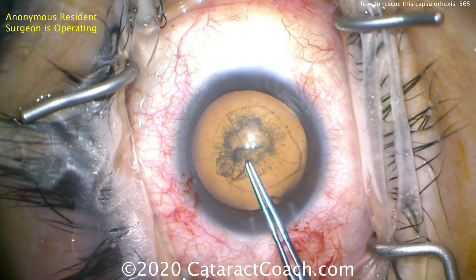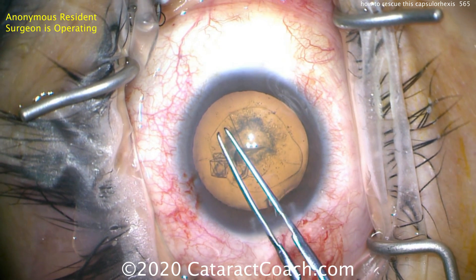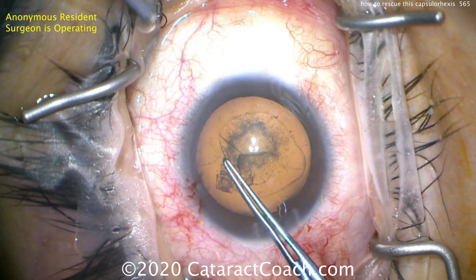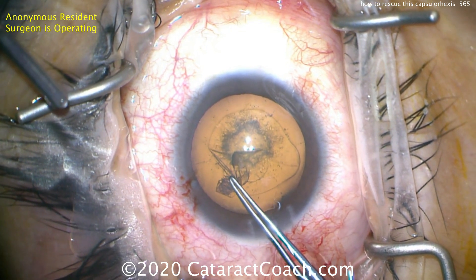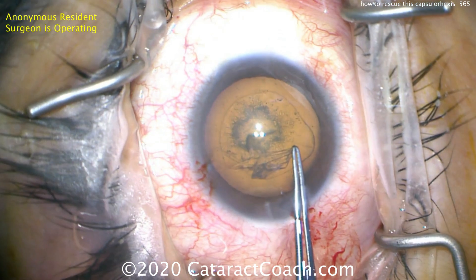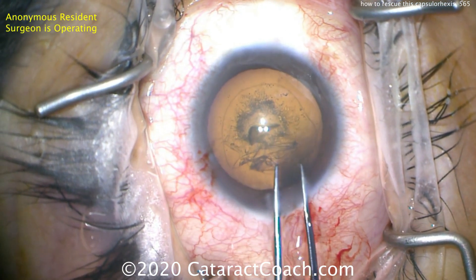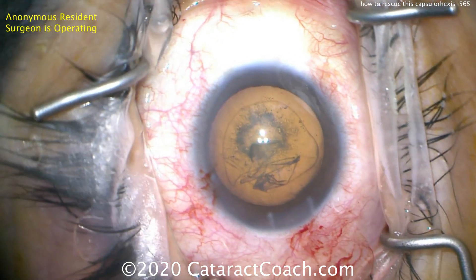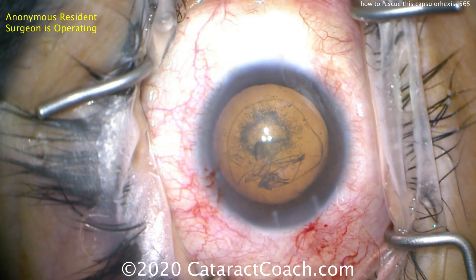Let's try one more time with the rhexis. Going inside with the forceps — good technique — lining it up, grabbing the capsule here, bringing it around. So far so good. Now here's where you need to either re-grab it or flip the pivot, and again hitting the side of the incision, losing viscoelastic.